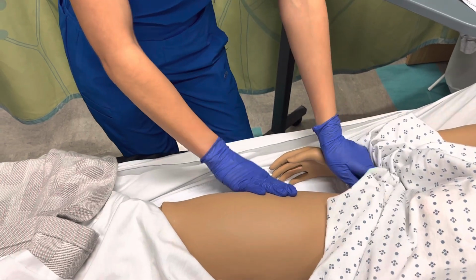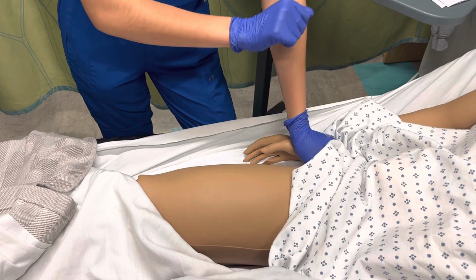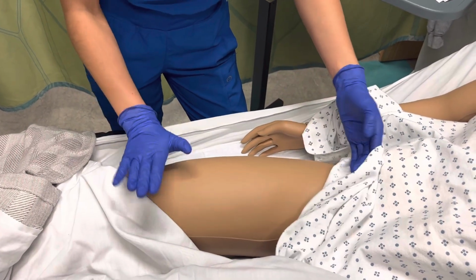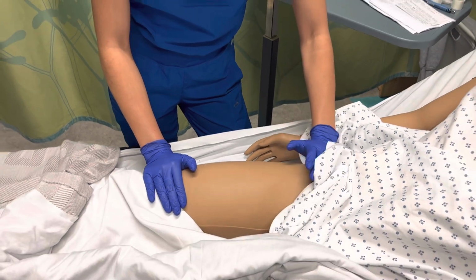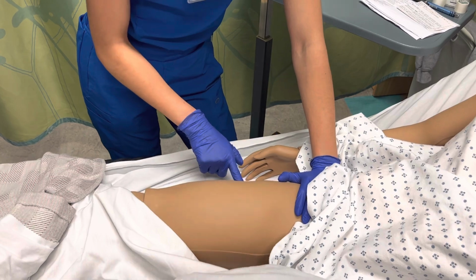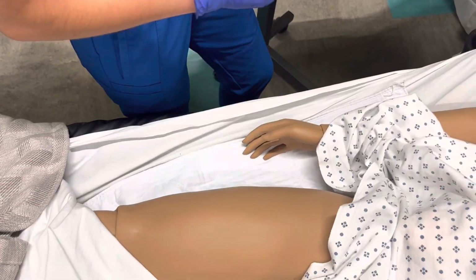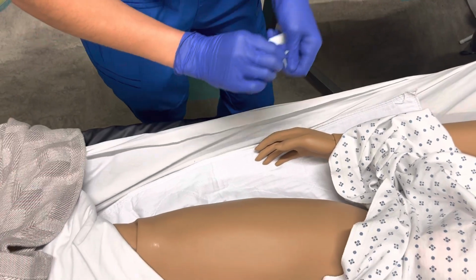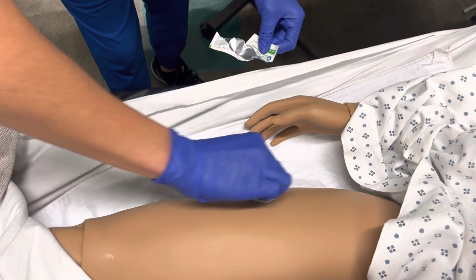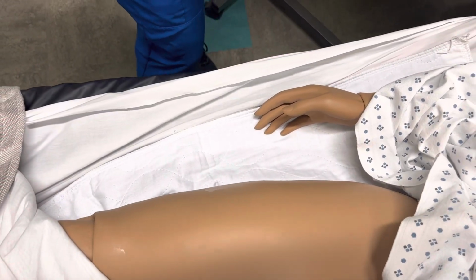The site that I will be using for my IM injection would be here at the leg. I'm going to put my hand above the knee here and find the head of my femur again. I will go to the center of the center right there. So I'm going to clean my spot right there, and let that dry completely.